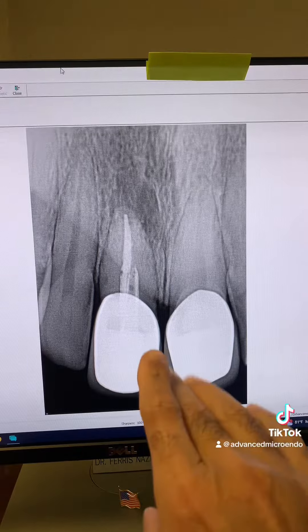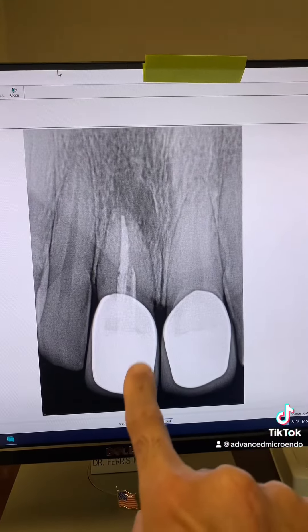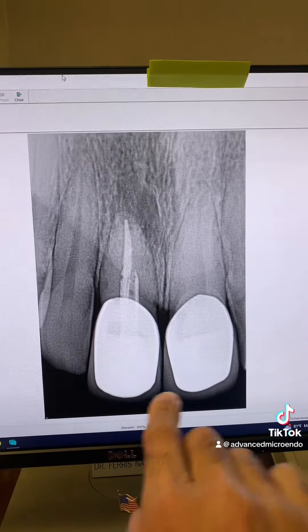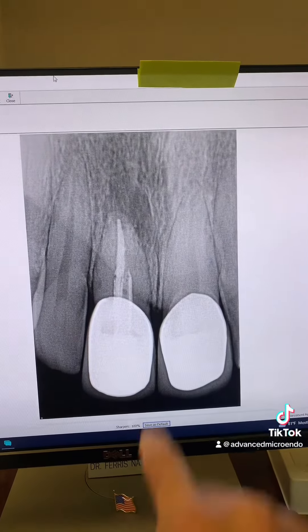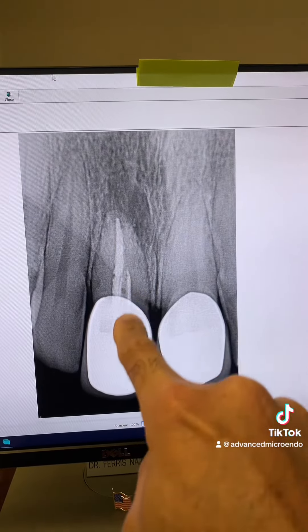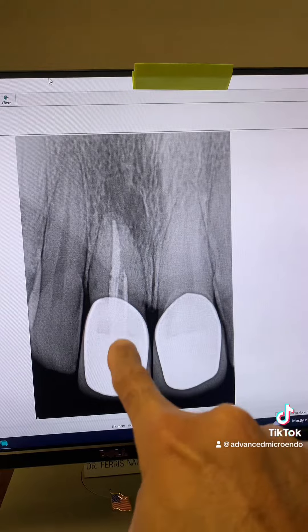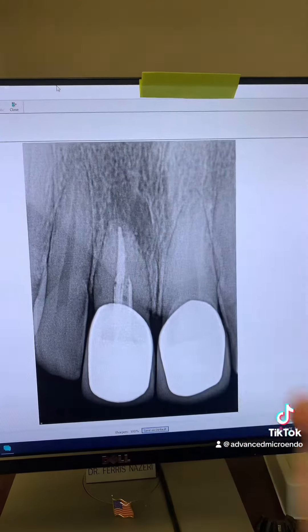When we saw him, we noticed that tooth number 8 was actually a little bit longer than tooth number 9 — it was protruded. As you can see, the previous root canal has a fiber post that appears off-center, and there is a large periapical lucency.